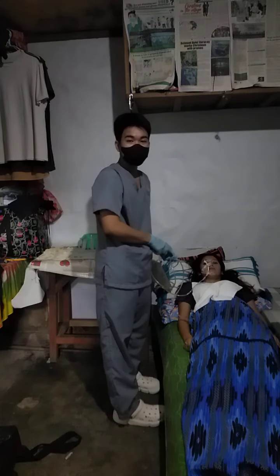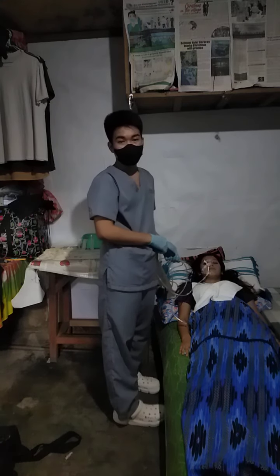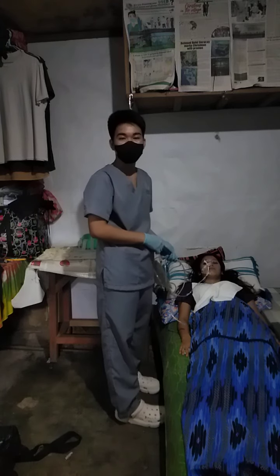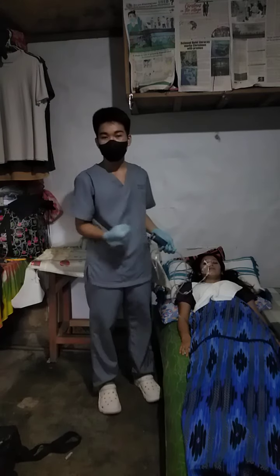Then discontinue the procedure and remove the tube if there are any signs of distress such as gasping, coughing, cyanosis, and inability to speak or hum. The tube is in the airway if the patient shows signs of distress and cannot speak or hum.